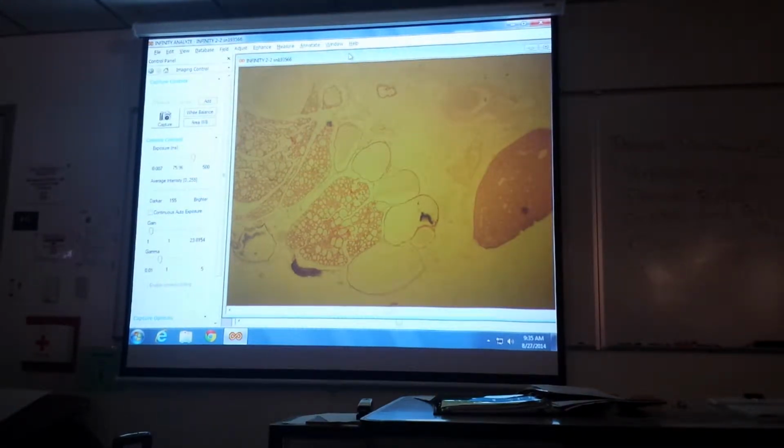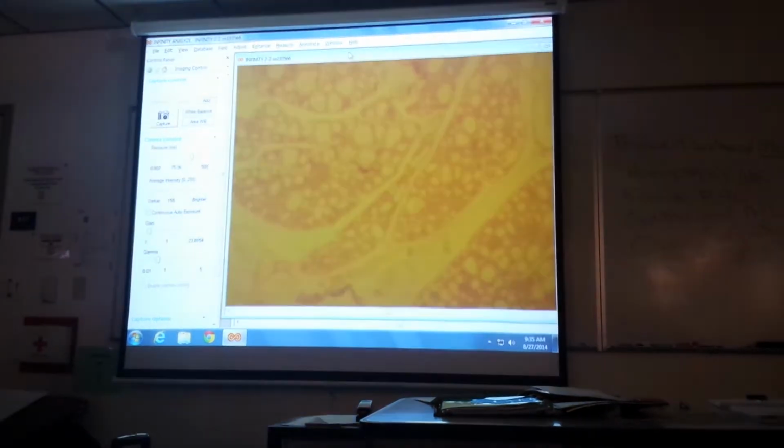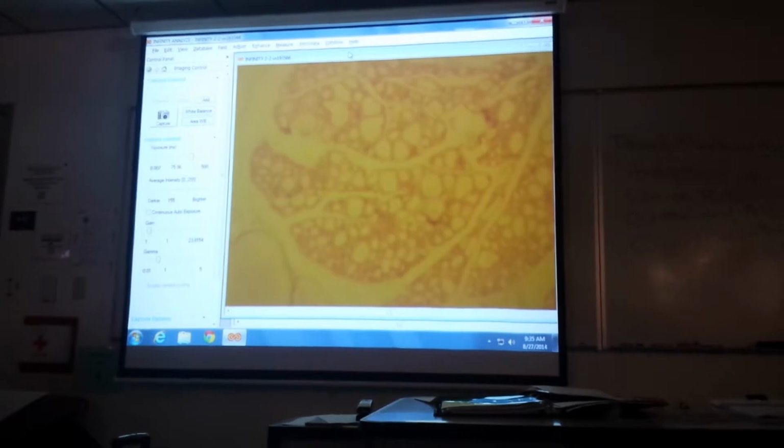So look at the follicle arrangement. We got to go to like 100, 400 to get a better view. So let's do that. To see cells, you got to go to 400. So here's 100. Here's what that looks like.